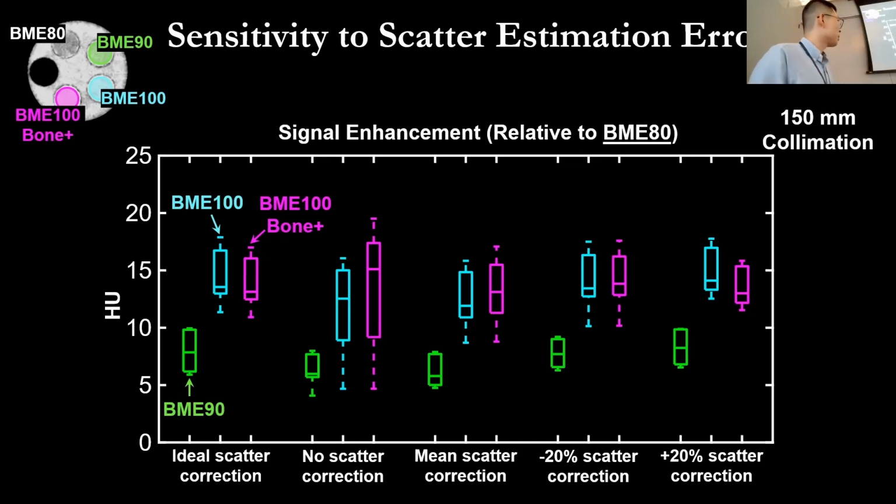By the way, if you're wondering why the BME 100 and BM 100 bone plots are similar, this is supposed to be the same value because we keep the same water and fat ratios and only change the bones in there. So theoretically, both of these show as pure bright signals, with the same equivalent amount of signal on this non-calcium image.